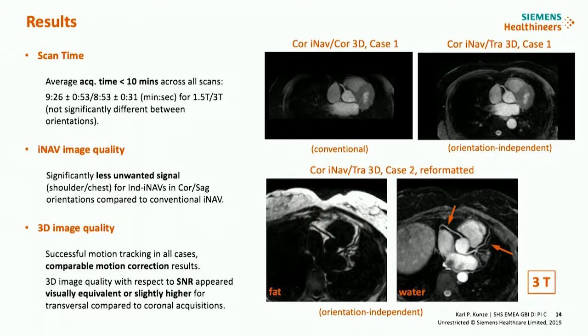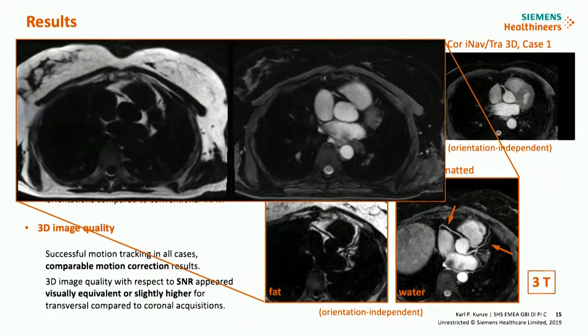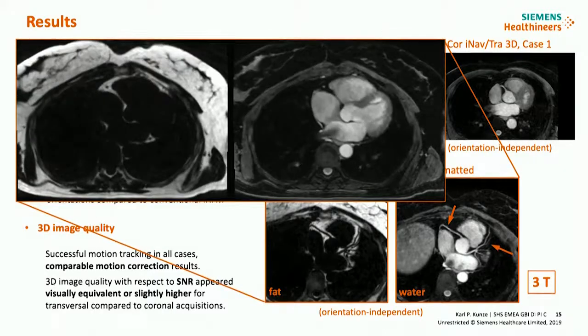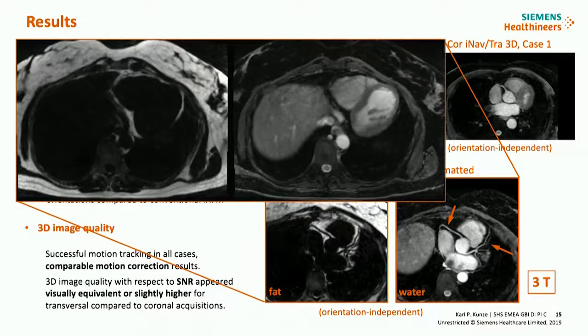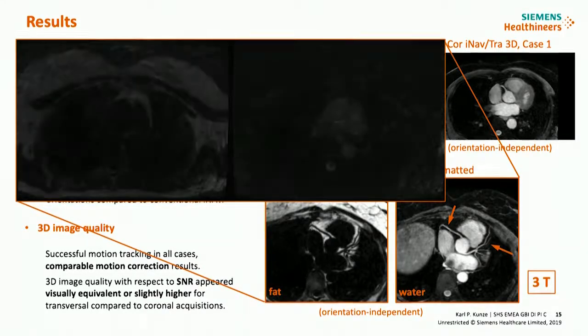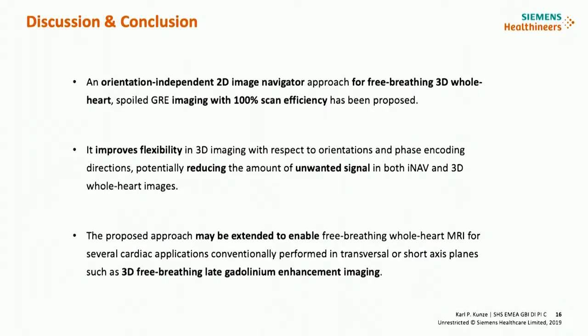proximal coronary arterial system. Again, the fat and the water image, and you could consider this a much more challenging subject because you have a lot of fat, but you can see that the fat suppression, again, is very good, and you can nicely delineate and follow all the details in the coronary arteries until relatively far down. Good. With that, I will conclude.